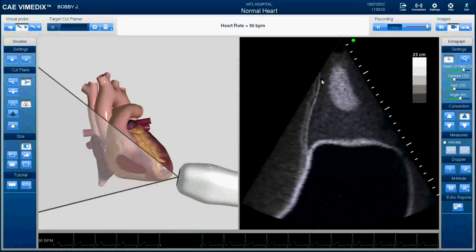This bottom side here corresponds to the bottom side on screen. Getting oriented on ultrasound is actually pretty difficult. Ultrasound works by projecting out a sound wave, and then the crystals on the inside send that to the computer, and the computer interpolates and analyzes it and gives you a signal back.